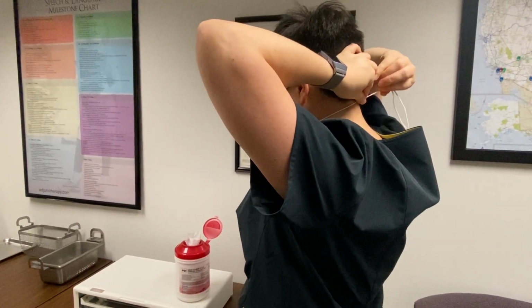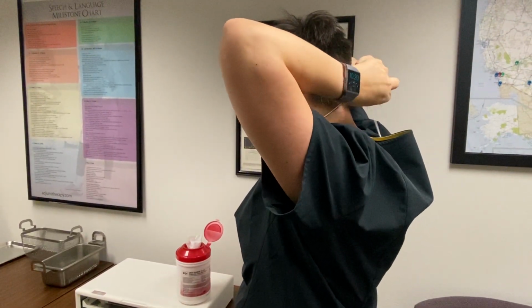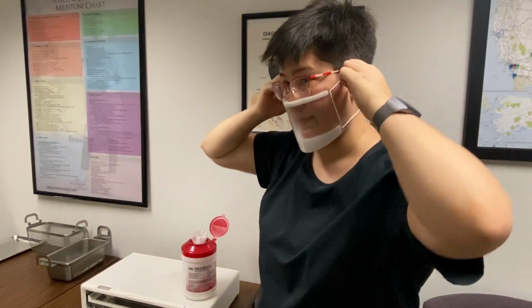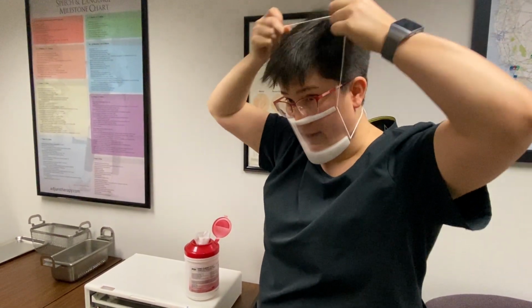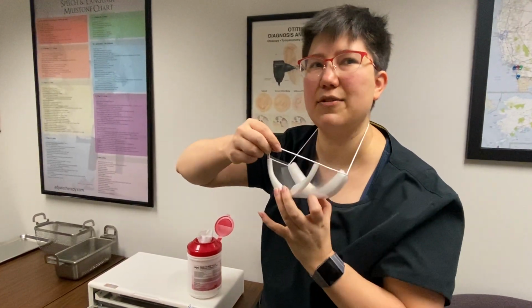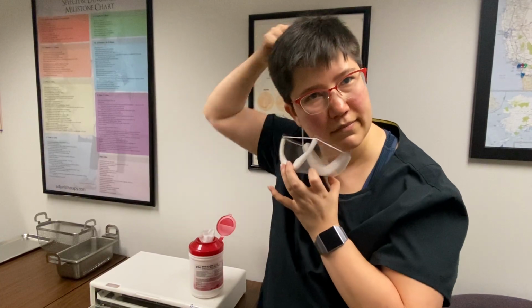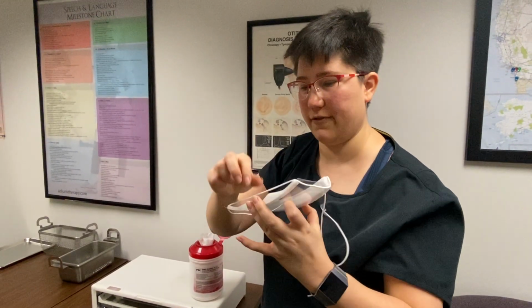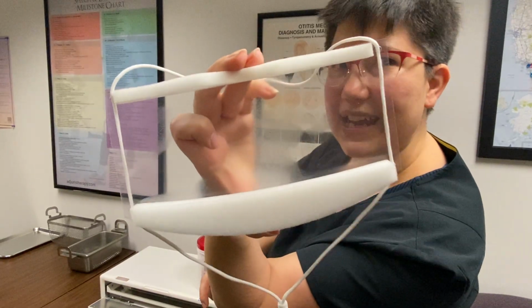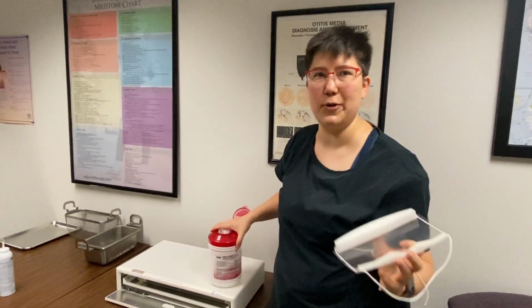So to get it off, proper doffing, you pull this back a little bit. Make sure you don't pull it all the way off. To loosen it up, you pull the top part here, and then holding the outside, loosen it up and pull the string off. Now, see how gross and spitty that is? We need to wipe it down.